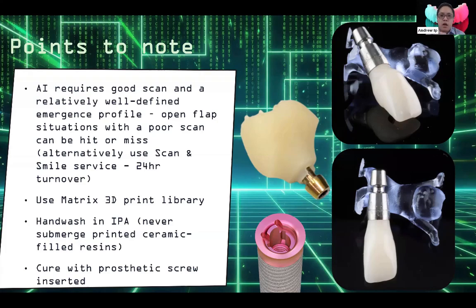This is going to change very soon because you'll see many companies come up with alternative washing solutions. So Pacten or Rodin is coming up with one. I think Ceramica has their own spin on it, and it's been in the market for, I think, 4 or 5 years now. So non-alcohol based washing solutions. I think that's something to keep an eye on.